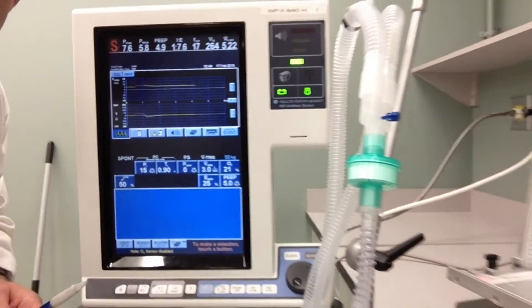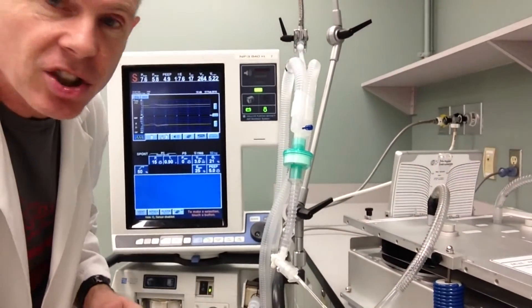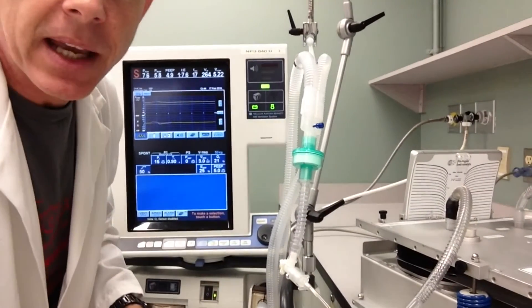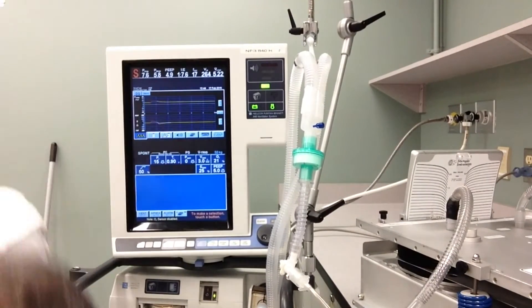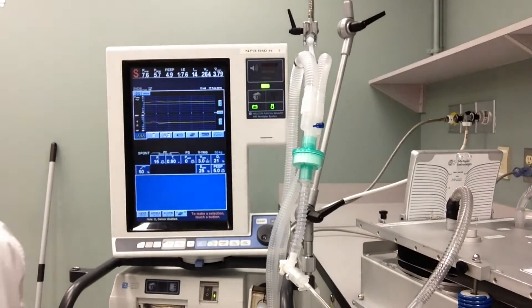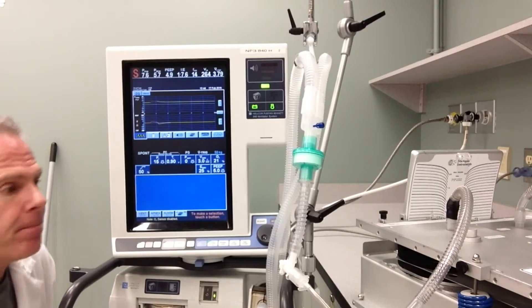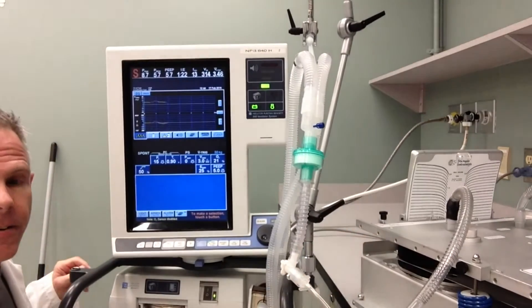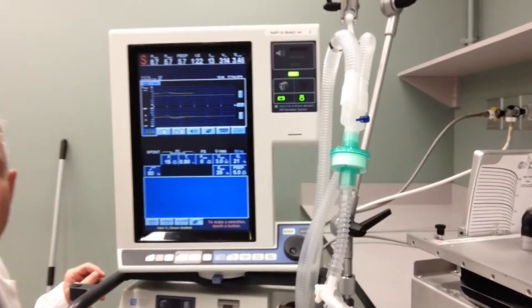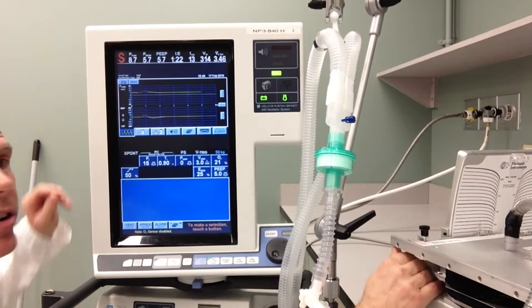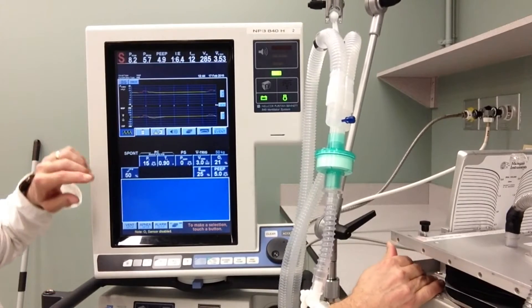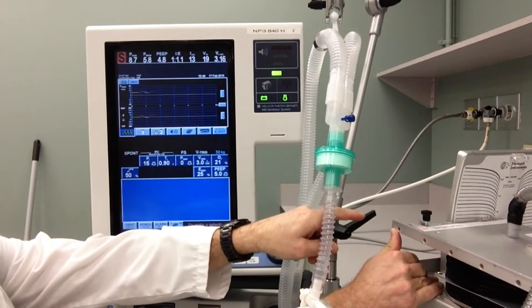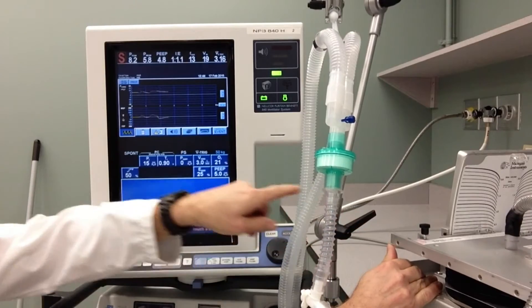I'm going to move back a bit so you can see me mimicking the spontaneous breathing of the patient. This is the patient breathing spontaneously. Just out of the corner of your eye, I hope you can see that spontaneous inspiratory effort — that's a breath in.